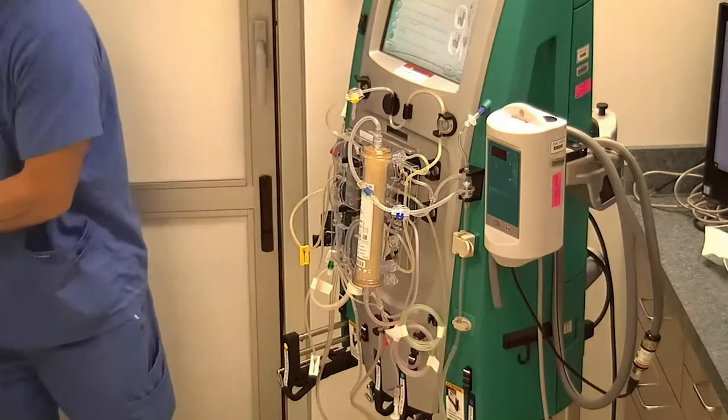Occasionally, this is the point where if you do get an alarm, sometimes one of these pumps doesn't load properly. You can see the tubing kind of sticking out of the pump. And all you would have to do is let the machine unload the tubing, then you would hit load again and slightly push in and help the machine guide the tubing onto the pumps. But from here we're good to go, so we're just going to confirm that we have the M150.